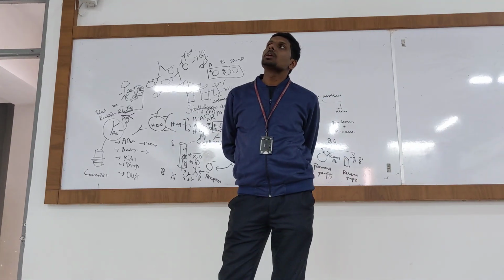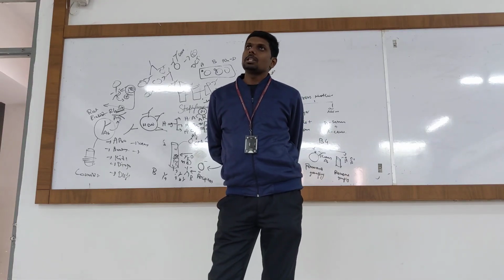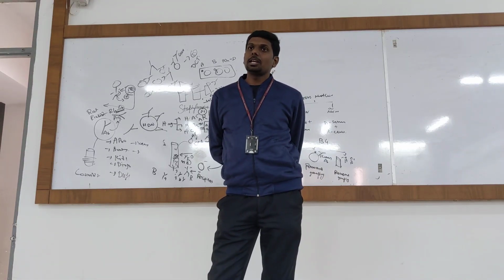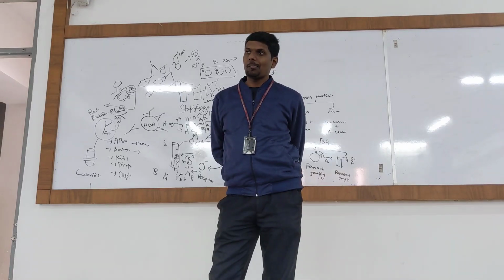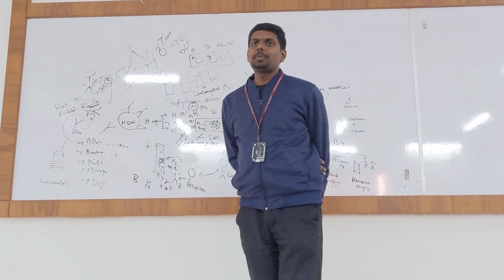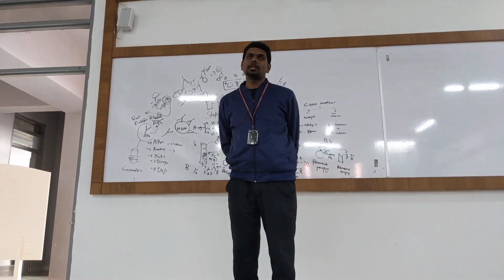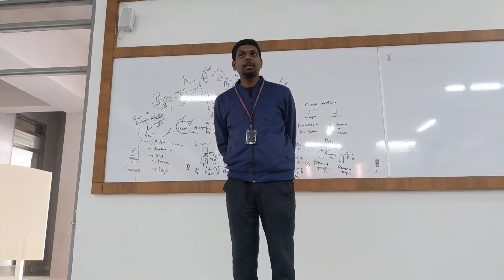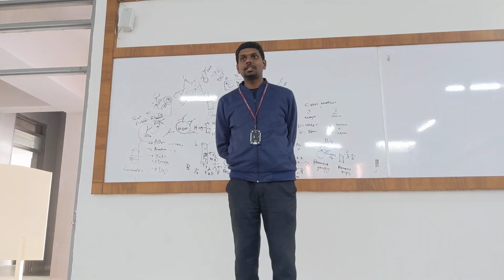In the Bombay group, antibodies can be detected by the Coombs test because his blood might be sensitized with those antibodies on his red blood cells.